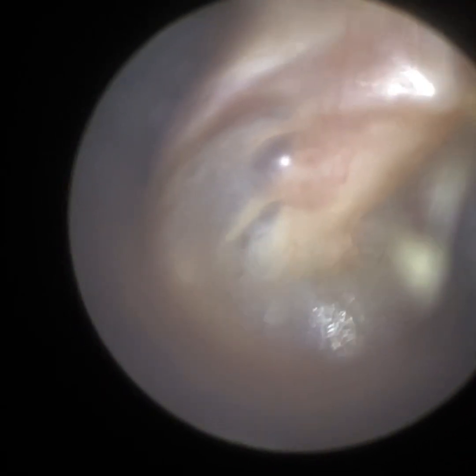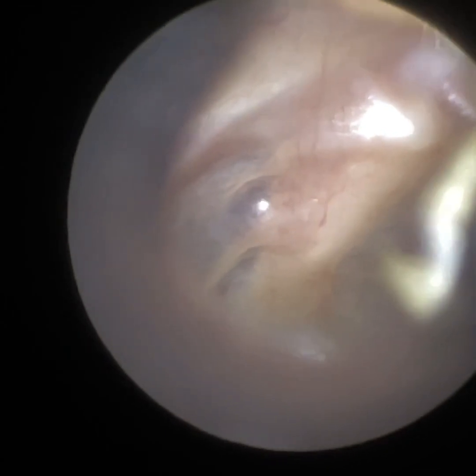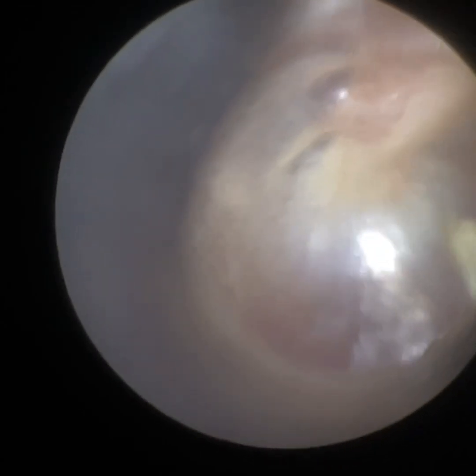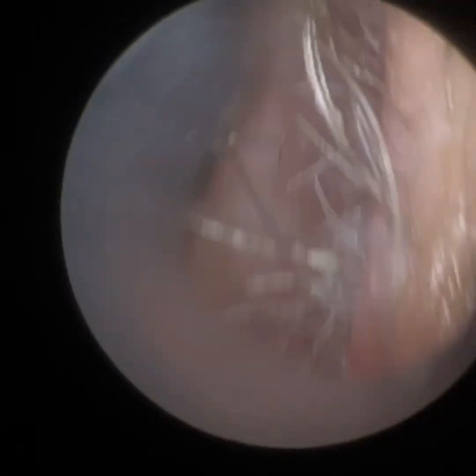So it's a bit of a bendy ear this side. You can see posteriorly the retraction and in the attic the eardrum is sucked inwards. Just adjusting the focus there, but it's nowhere near as retracted as their left ear.